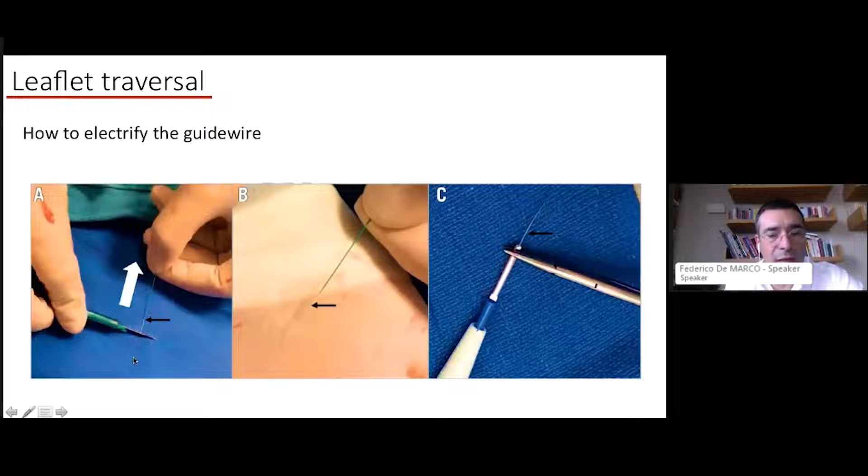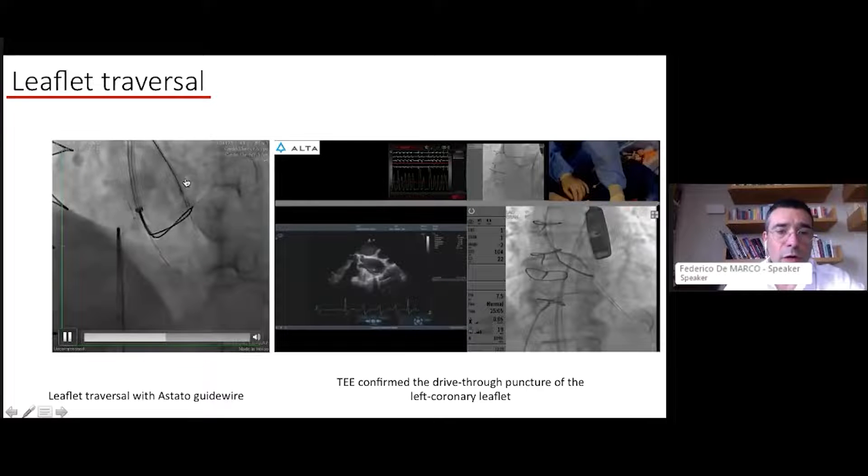To electrify your system, peel away the back end of your Astato guide wire with a scalpel to expose the metal portion, then clamp an electric scalpel secured with a hemostat to the peeled portion. Set your radiofrequency generator to between 50 and 80 watts — a very high energy delivery concentrated at the tip of your 0.014 guide wire. Then traverse the leaflet by electrifying the system; the wire crosses like a hot knife through butter — very easy, unless there is heavy calcification.